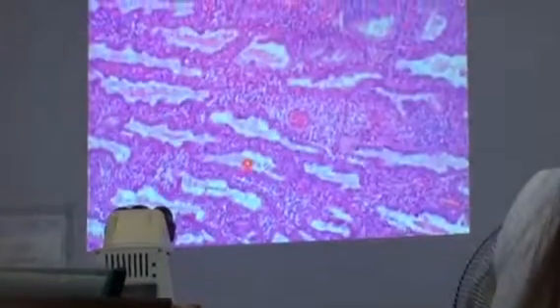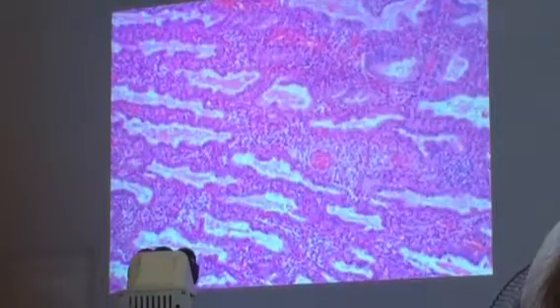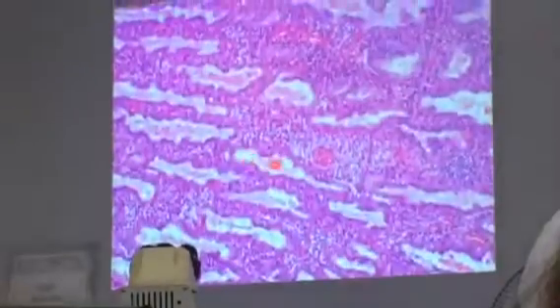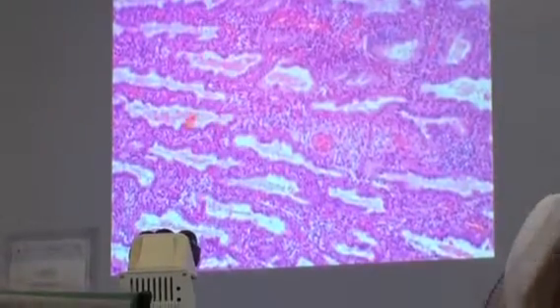In the secretory phase, since the proliferative phase has finished, the nuclei are more relaxed, and since the stroma has caught up, the shape of the glands now becomes spiral. They start to coil. That's why when you look at a longitudinal section, it looks zigzag.